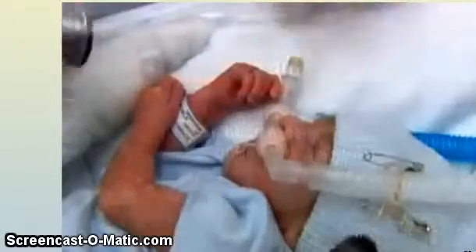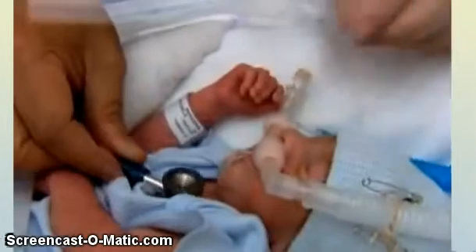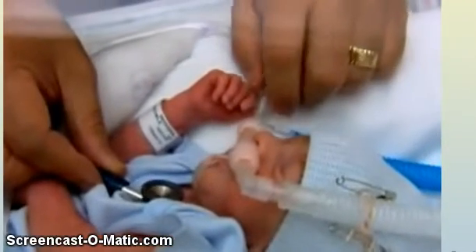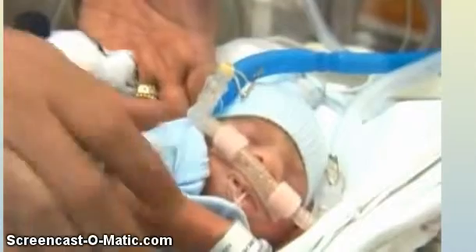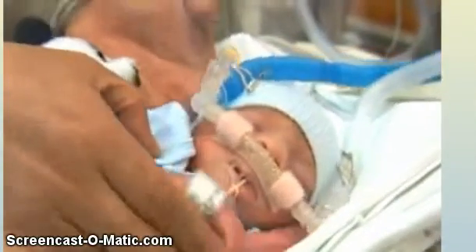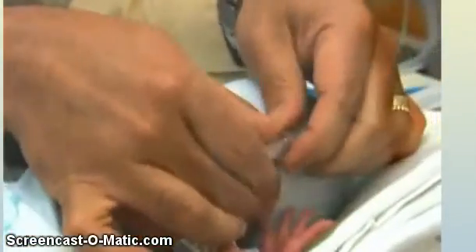Columbia University medical experts from Morgan Stanley Children's Hospital of New York Presbyterian will host a webcast discussion on the use of bubble CPAP therapy for newborns with respiratory distress syndrome. CPAP stands for Continuous Positive Airway Pressure. Bubble CPAP is a low-tech, labor-intensive therapy that is performed to prevent chronic lung disease. Chronic lung disease is a serious problem.